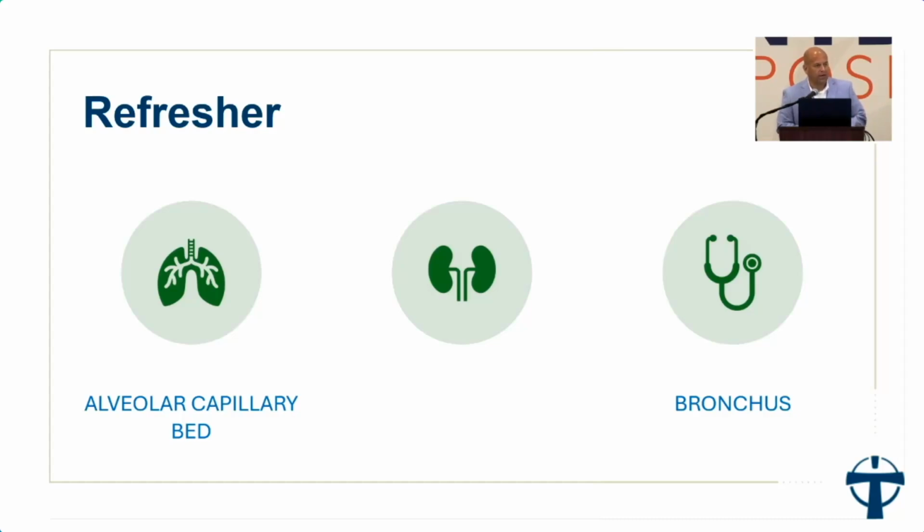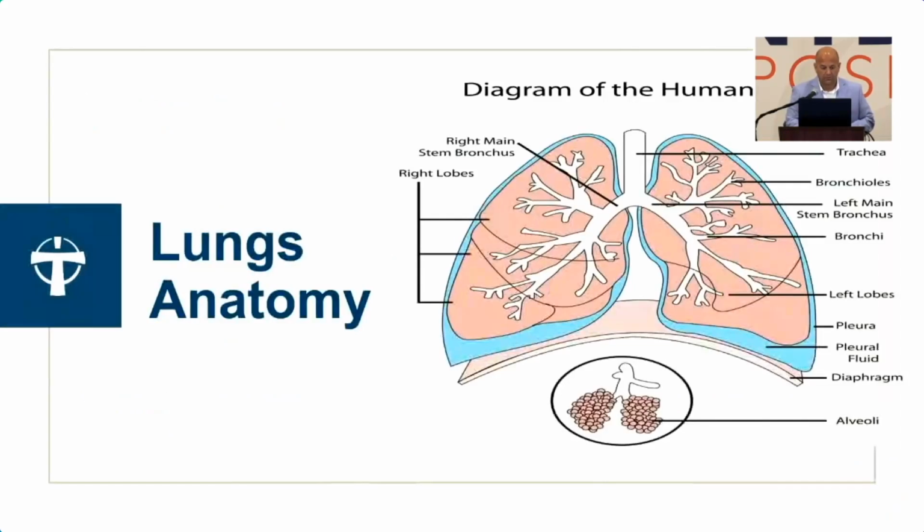Or are they a congenital cardiac patient? I remember in my pediatric cardiac surgical unit, PEEP was a bad word. A lot of times we had patients come out of cardiac surgery with no PEEP. From an RT perspective, it's like, what are we doing? But it works, right? And then the bronchus delivers air. You have a right main stem bronchus. Again, going back to congenital defects, it could make a major difference in how you ventilate your patients.